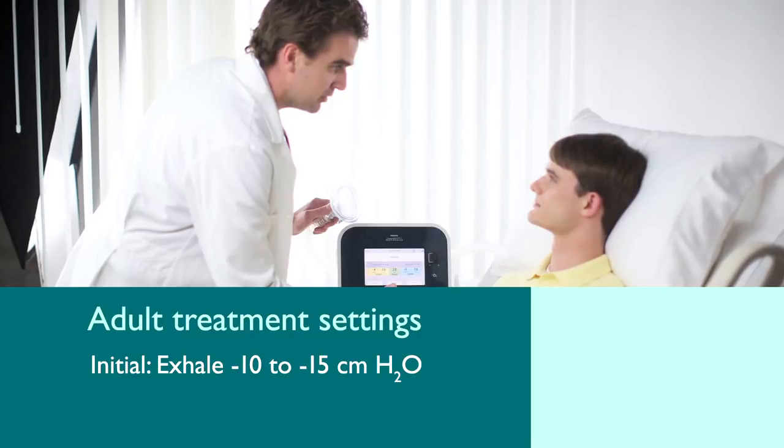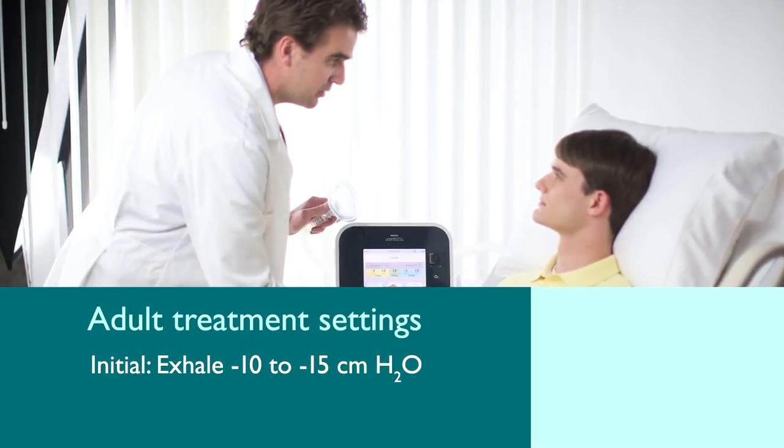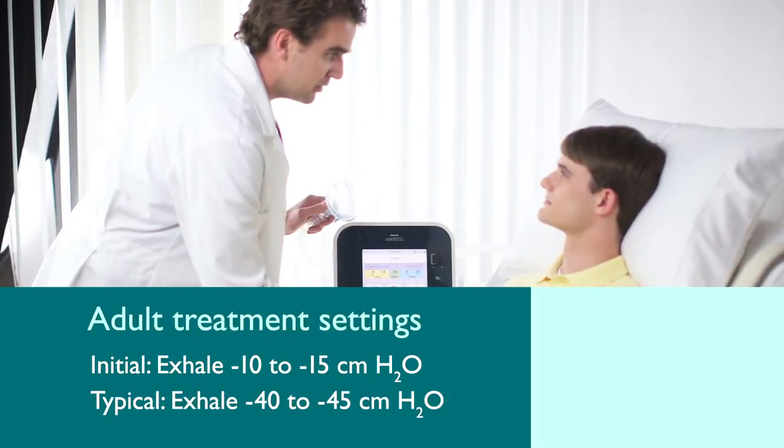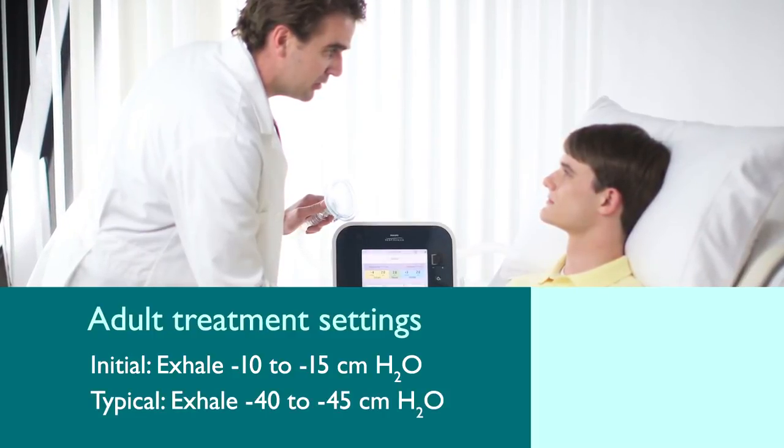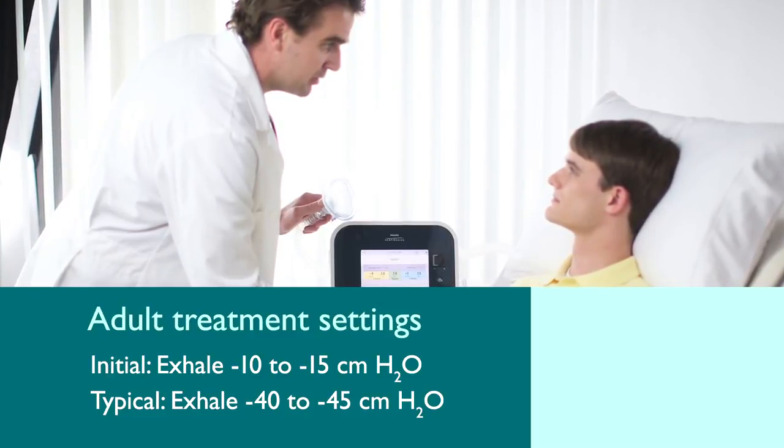For an initial treatment, a low exhale pressure of negative 10 to negative 15 cmH2O may be a good starting point for an adult. Once the patient is accustomed to the therapy, exhale pressures of negative 40 to negative 45 cmH2O may prove more effective at clearing the airway.